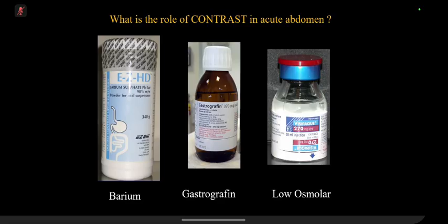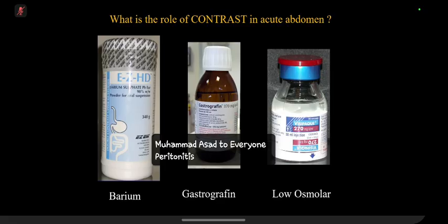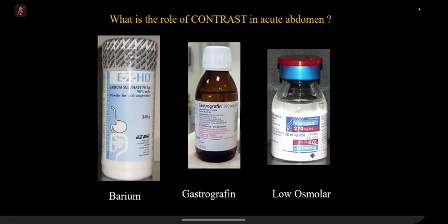If you are worried about perforation, for example post-operative perforation, you don't use barium, because if barium goes into the peritoneal cavity, it will just deposit there. It will cause fibrosis, long-term complications. So the take-home point: don't use it in the abdominal cavity where there is perforation.